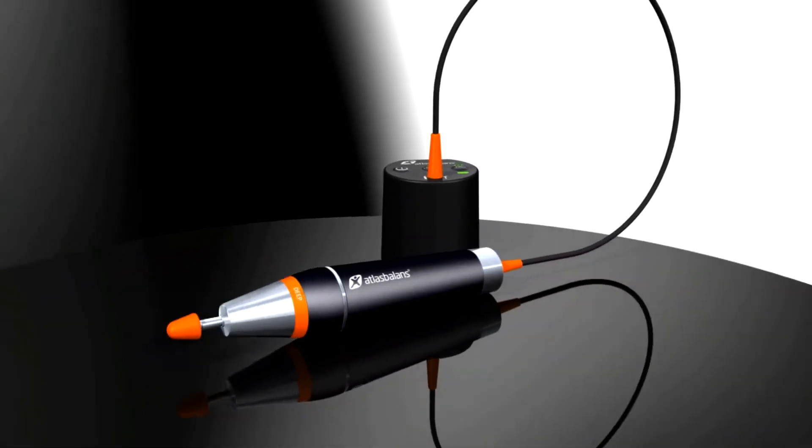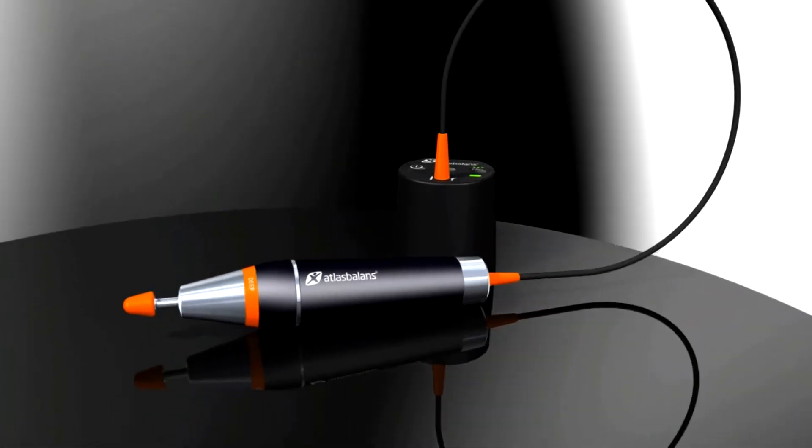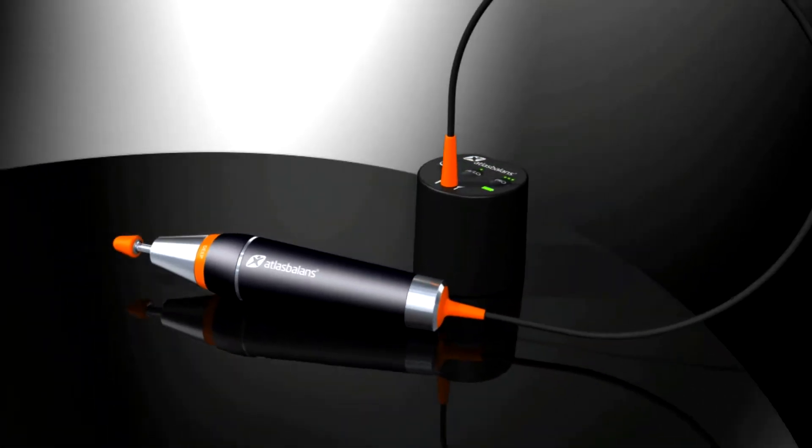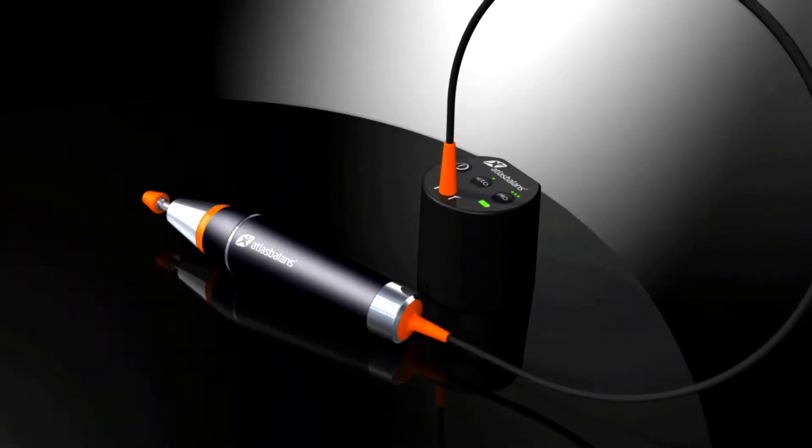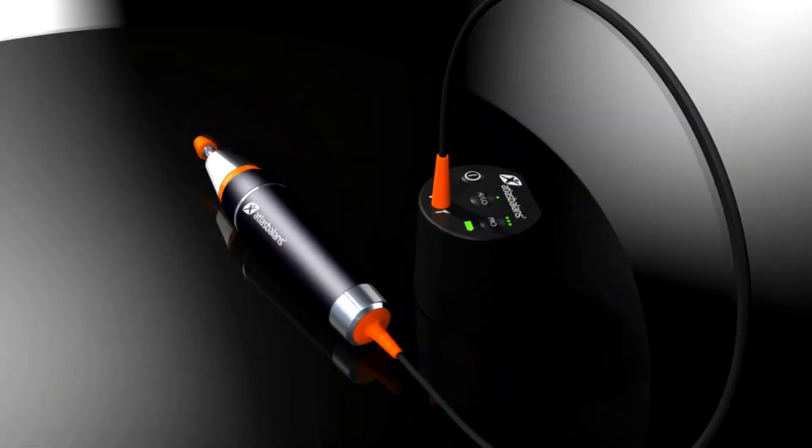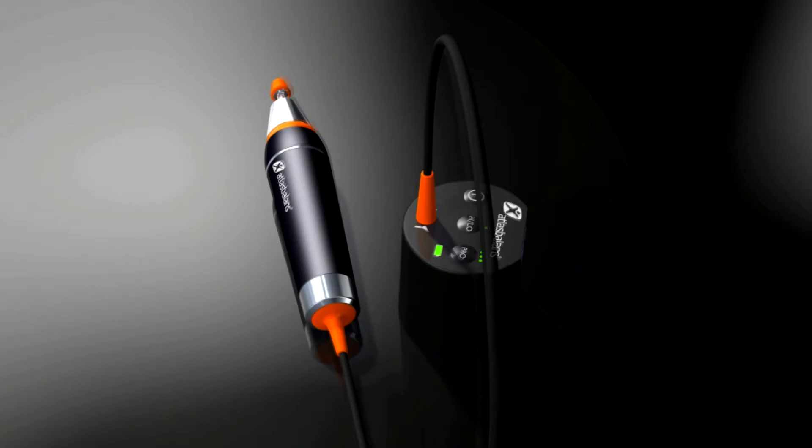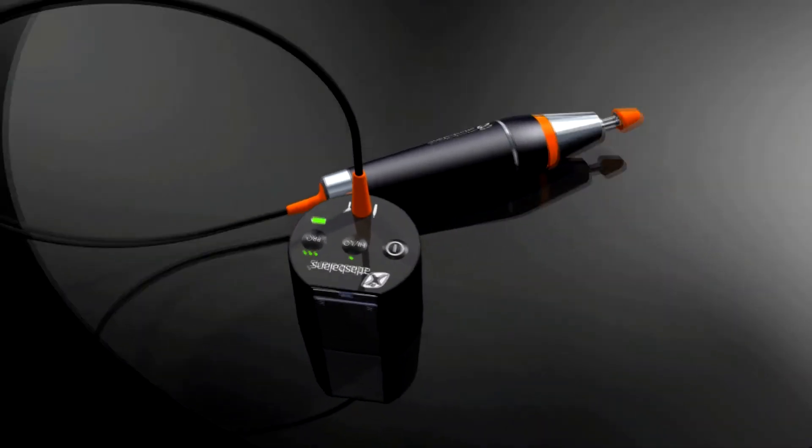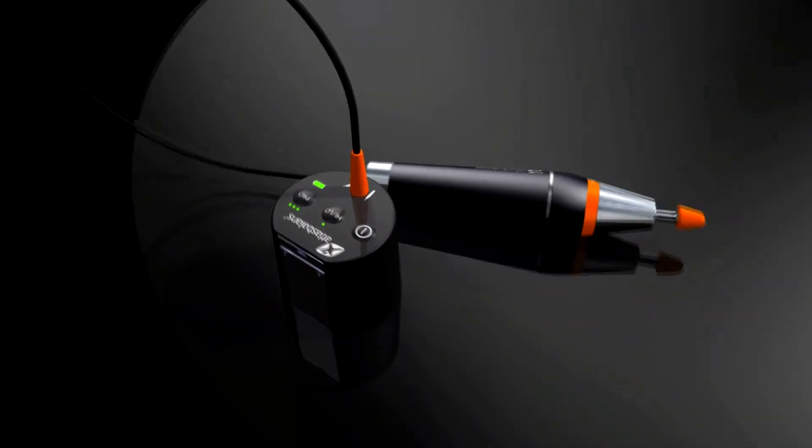The M1 generates between 400 and 1200 harmonic pulsations per minute, creating waves that spread to the fascia like rings in water, treating large areas widely and deeply.